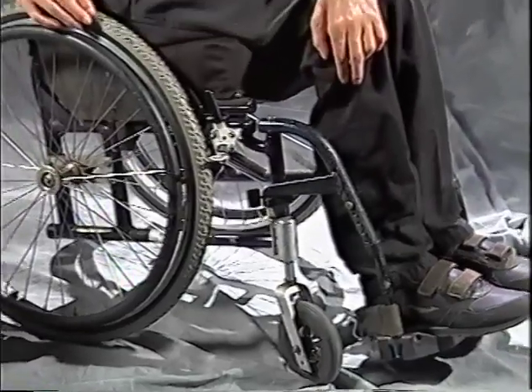Once you determine the seat dump and the seat height and all, then you can determine where you set the caster angle. Let's spend a moment and look at camber on a wheelchair and what you have it for and how you go about getting some. Camber is basically used to help the chair to turn. It's the same principle as a bicycle wheel. When you slant your bicycle on an angle, your bicycle will turn the corner. If the chair is made to do a lot of cornering, you want a lot of camber.